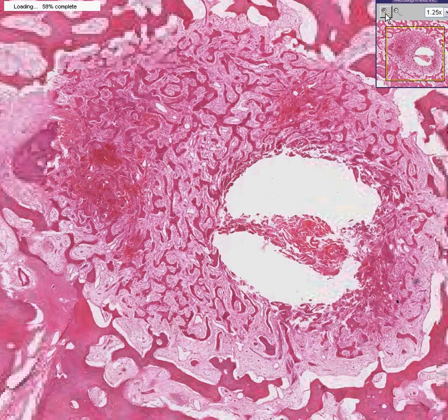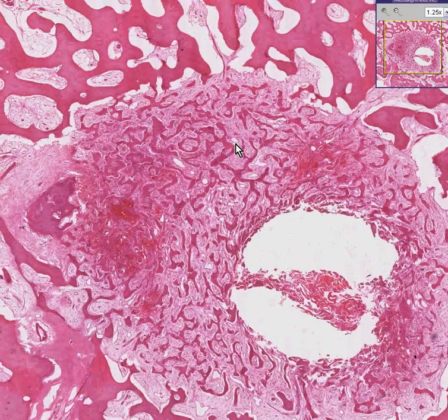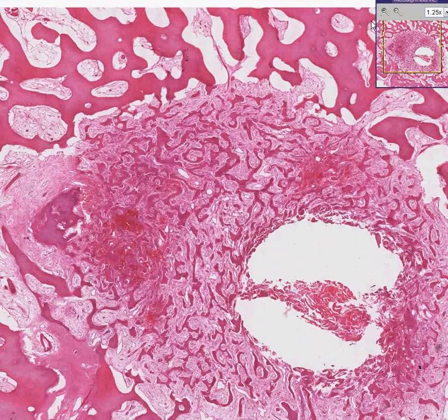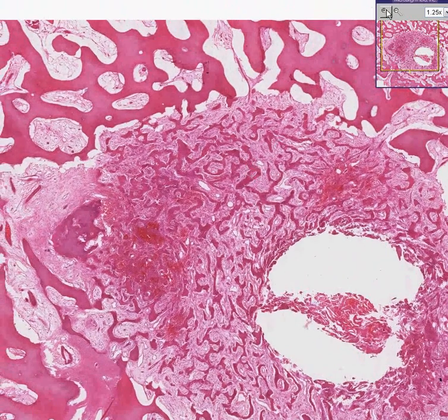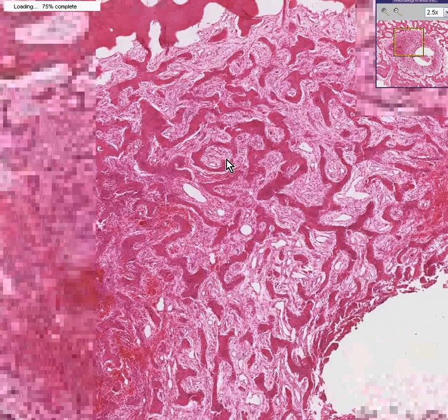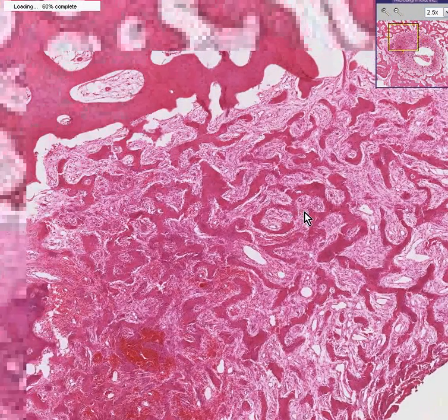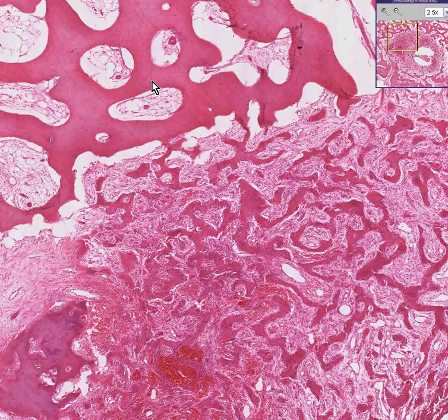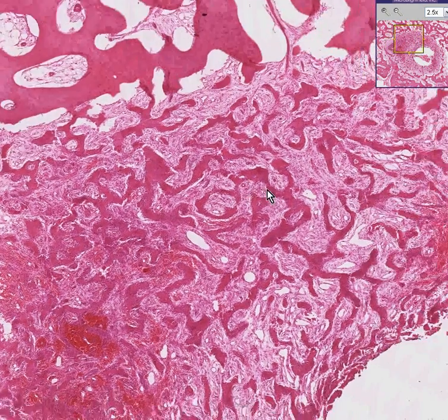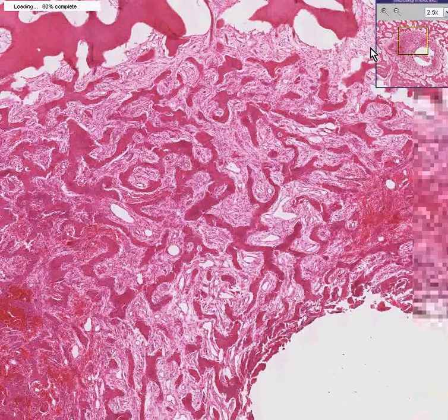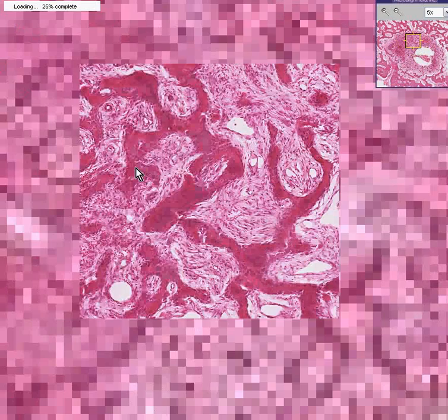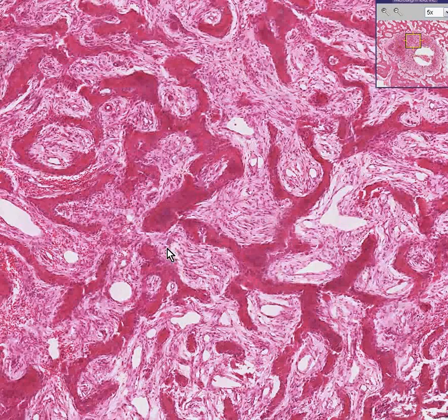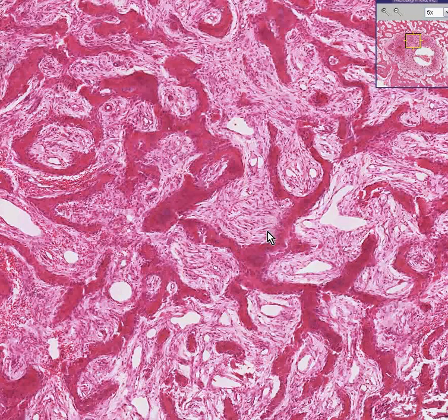If you look carefully, the bone tissue and spicules within the osteoma are not terribly different from the so-called normal surrounding bone spicules, except they are a little thinner and they may have a little more fibrous tissue rather than fat. Also notice that there are a lot of blood vessels within this fibrous tissue as well.